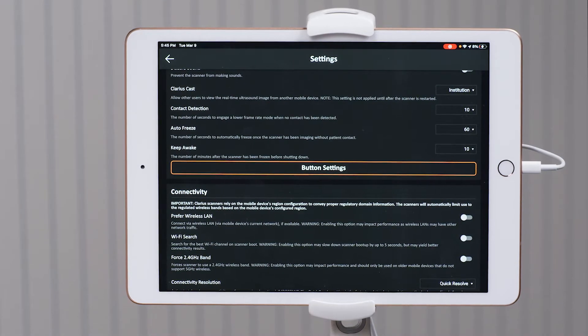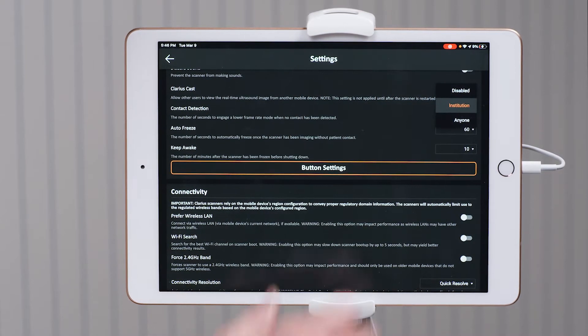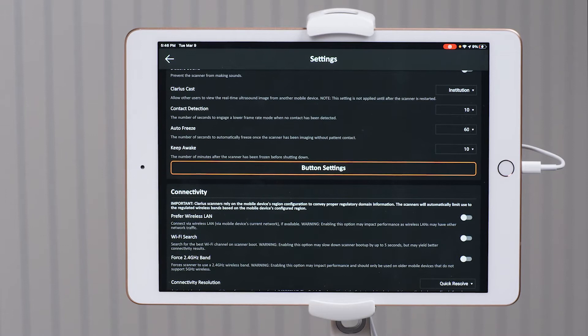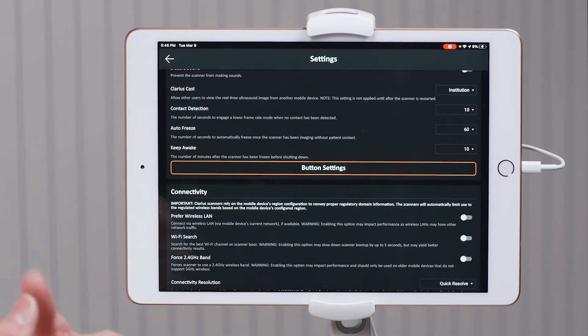Clarius Cast is a really great feature if you're doing obstetrics or are at a teaching institution. Through the drop-down menu, if it's disabled, you would select institution. At that point, up to five people in your clinic can download the app to their device, and as long as they're within range of the direct Wi-Fi of your scanner, they will be able to view what you're scanning. This is great for residency programs or in obstetrics where the mother would like to observe while you're scanning her baby.